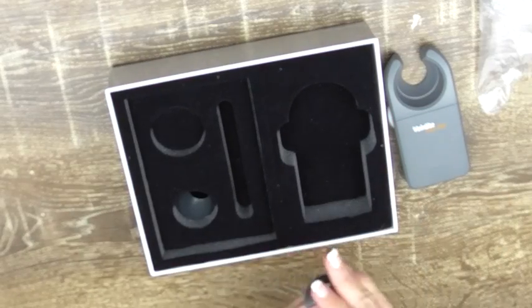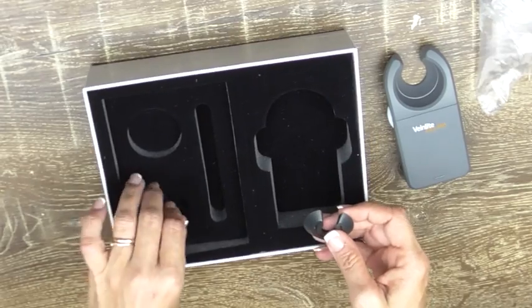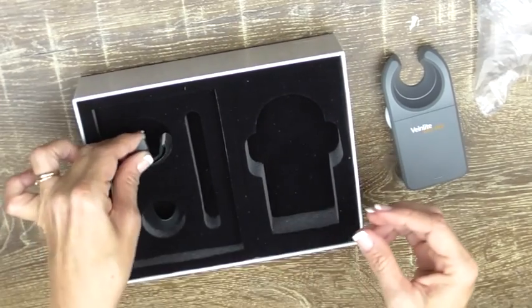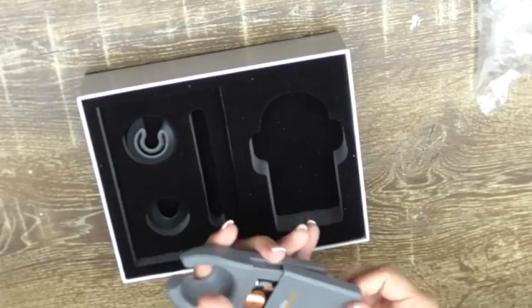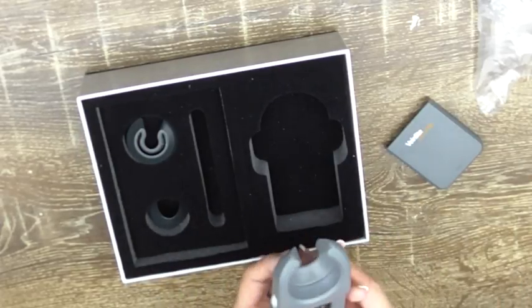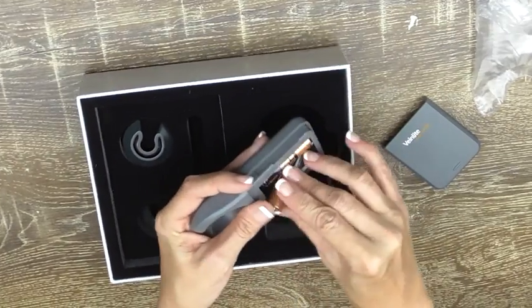When you're storing the device and not using it for long periods, I would recommend putting it back in the box and taking the batteries out, just so that they don't go rusty and do any damage to your Vena Light.